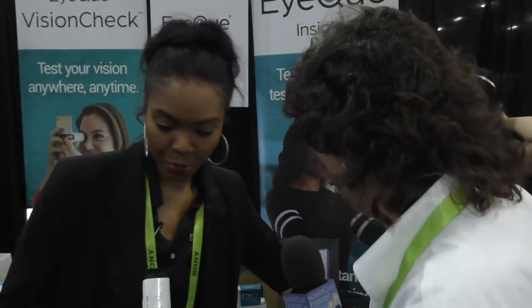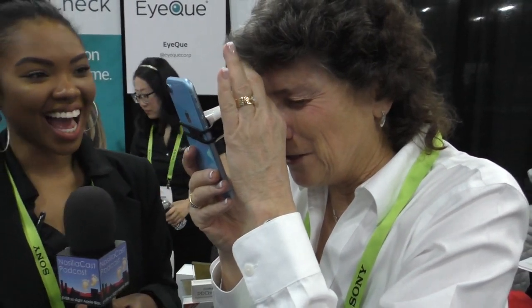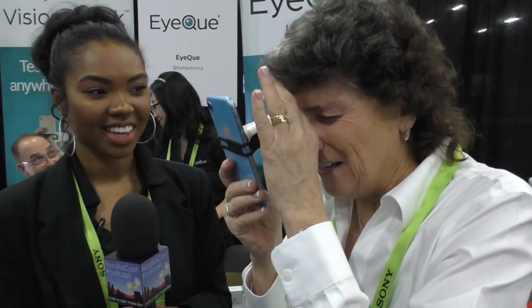Then it's going to give you what we call eyeglass numbers — the numbers you use to go on websites like Zenni Optical or I Buy Direct to order glasses online. Does it work with astigmatism? Yes — it measures spherical, cylindrical, and it will give you the axis of where your astigmatism occurs. Maybe it'll handle my funhouse eyes — let's give it a challenge! So I'm using two buttons to move the lines closer together or further apart, then rotate.